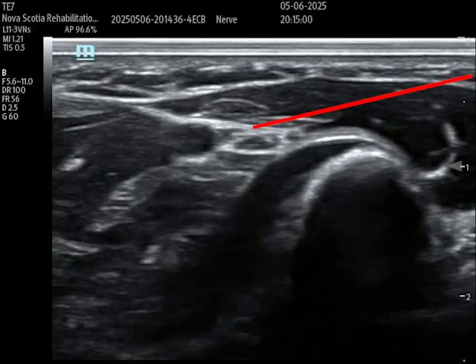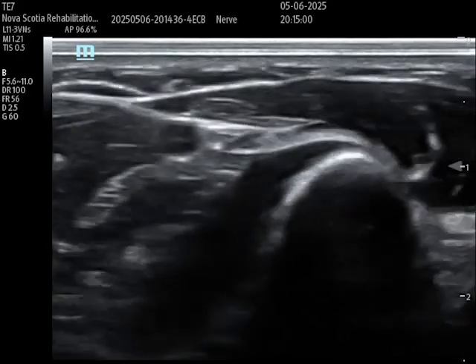If I was going to do a nerve block here in the distal forearm, I could bring the needle in, simulating that path here in red from the ulnar aspect to radially, bringing that needle near the nerve, near the blood vessel, and stimulating.